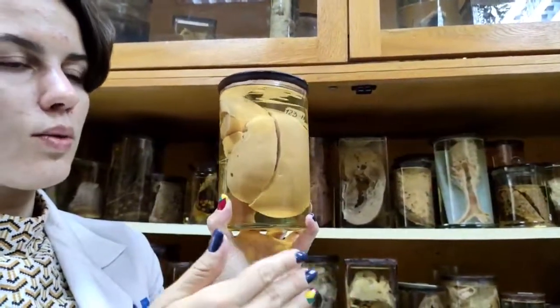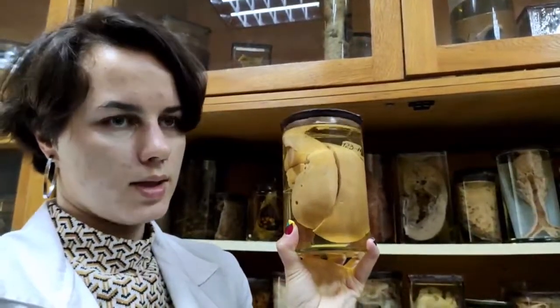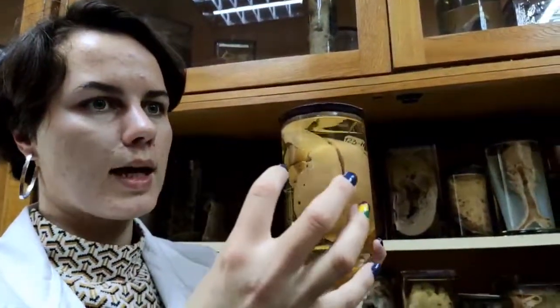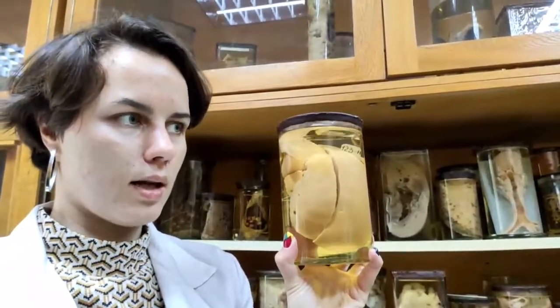Under the microscope, when you see the slide, you will also have this specimen, steatosis, in your list. You should know that there are two main kinds of steatosis, macrovesicular and microvesicular. Macrovesicular means that the droplets in the cytoplasm are big, and the nucleus of the hepatocyte is pushed towards the border of the cell.